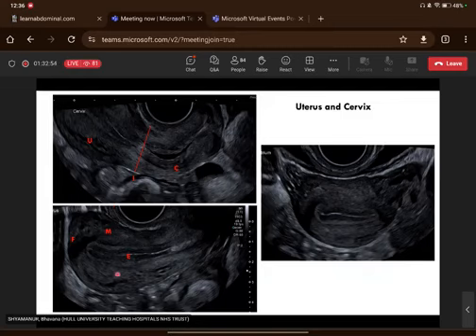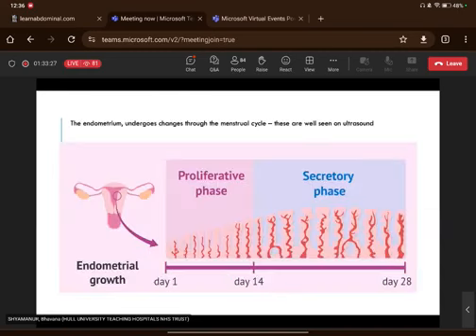And here's another look at the uterus, so you can see the central endometrium. It does look different according to the menstrual cycle, and we'll go into that really quickly soon. And then, so that's the longitudinal view. And once you rotate the probe anti-clockwise again, you get a transverse, or an axial view through it. So this is a transverse section of the uterus, central endometrium, and the adnexal structure starting to come off the side.